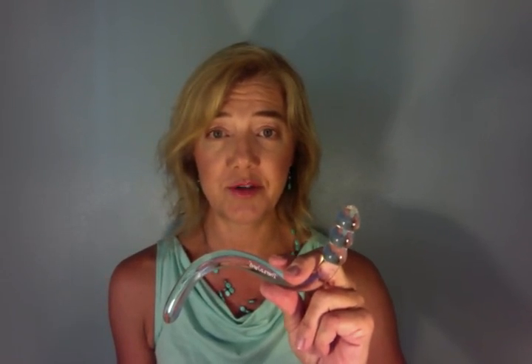The TheraWand is a curved crystal wand that is tapered at one end, curved in the middle, and blunt or rounded on the other end. Physical therapists trained in the management of pelvic pain conditions can use the TheraWand in the clinic to perform specific myofascial treatment techniques. Both women and men with pelvic pain conditions can use the TheraWand to perform these treatments on themselves as well. The curved design allows the user to easily insert and specifically target the muscles and tissues that need to be treated.